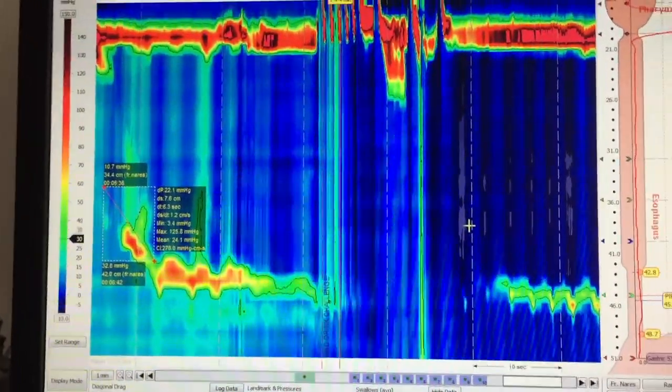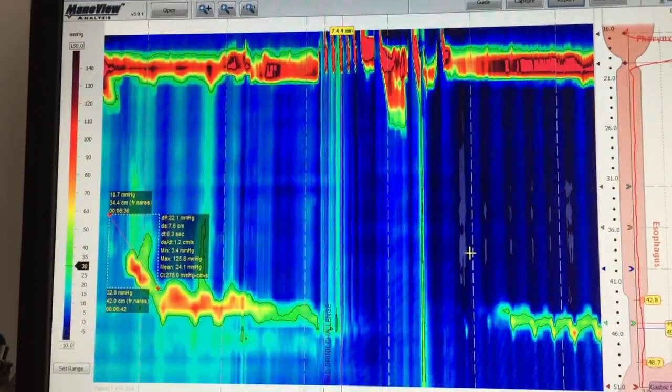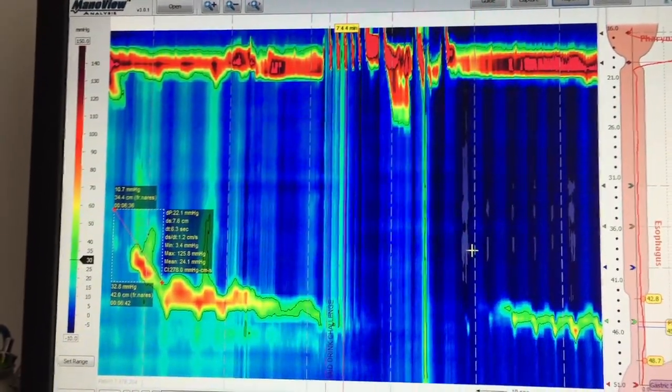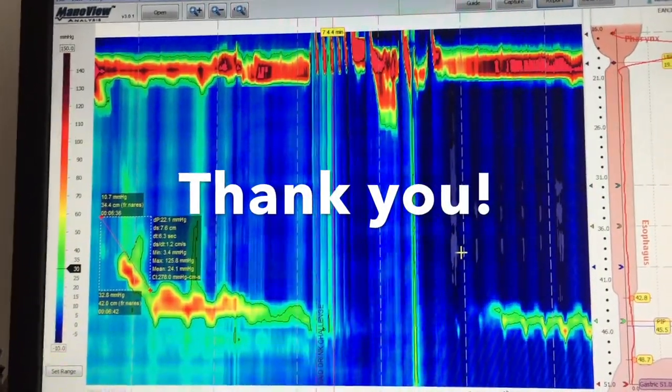So in this patient, we have normal swallows without a positive contractile response after the multiple rapid swallow. And in this patient, there is no contraindication to perform antireflux surgery. Thank you very much for your attention.